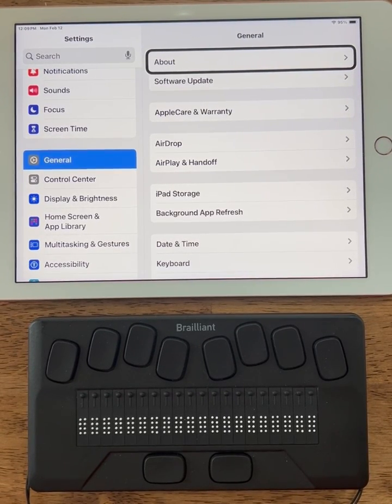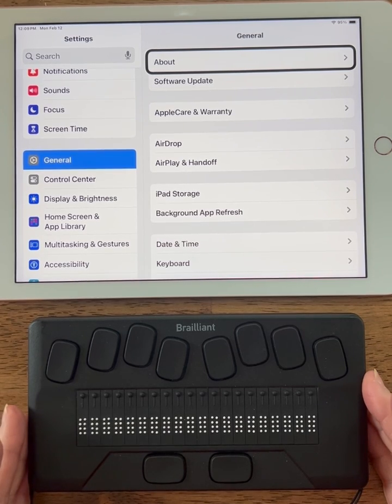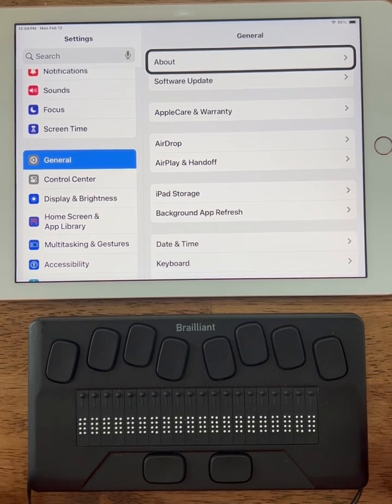This video is going to demonstrate how to pair the Brailliant BI 20X with an iPad. With the Brailliant BI 20X, the pairing process is accomplished through the Braille display, not the iPad. So let's go ahead and go through the steps.